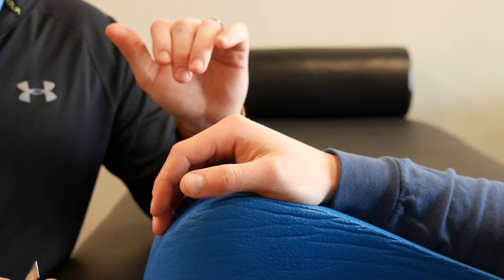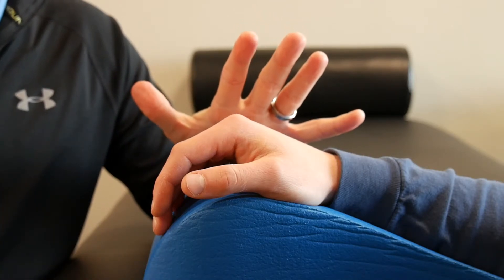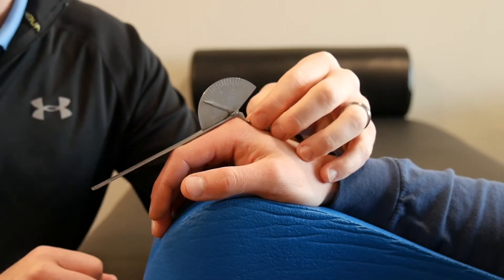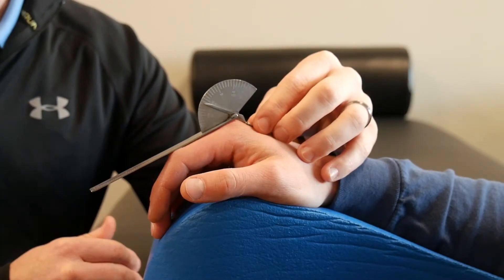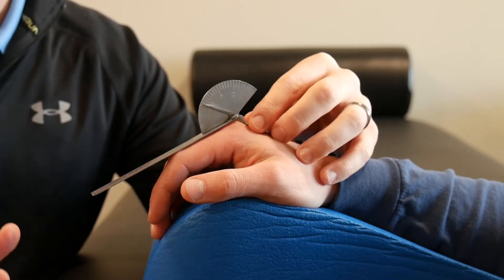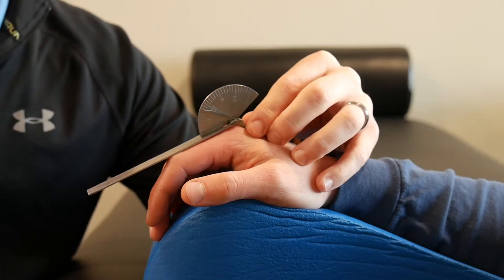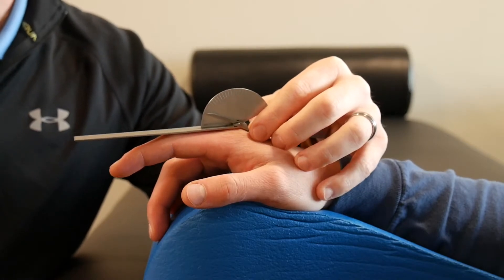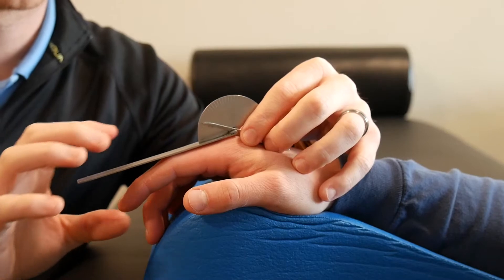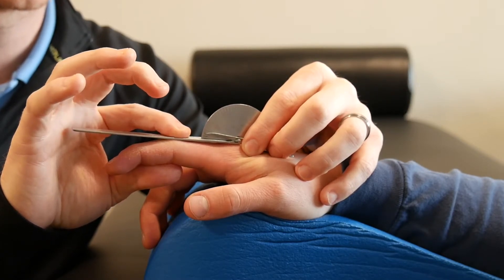For the MP joint, you can use one of these finger goniometers as long as it's neutral or less. If you start getting into hyperextension, we'll grab another goniometer. I'm going to lay this on the dorsal side of his hand. The stable arm is in line with the second metacarpal, and the movable end is laying right across his finger. A lot of times I just let the movable end balance on their finger and let their finger move the goniometer up. For this example, he's not going to go all the way to zero — we're sitting at about minus 25. For a passive measurement, you just take their finger and move it passively until you feel a firm block or until the patient can no longer tolerate the pressure.